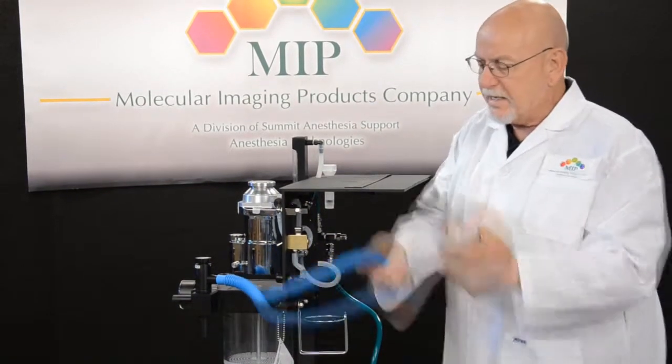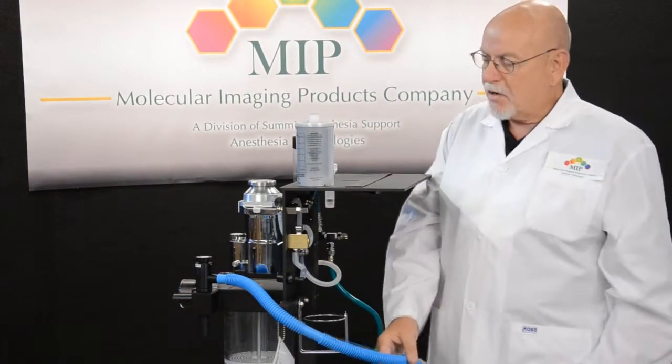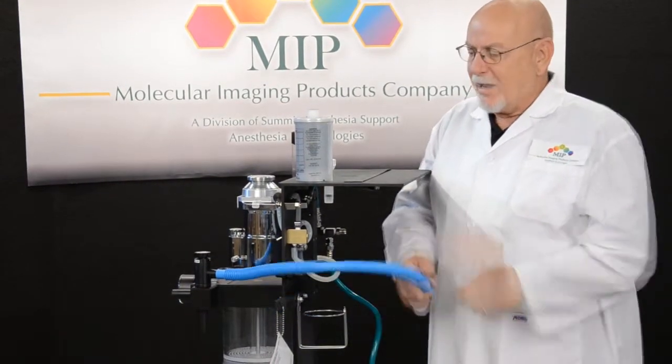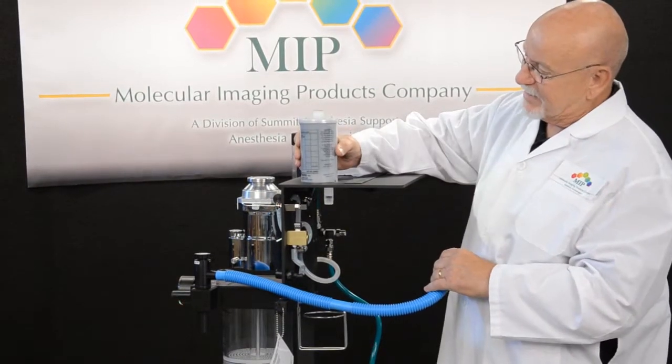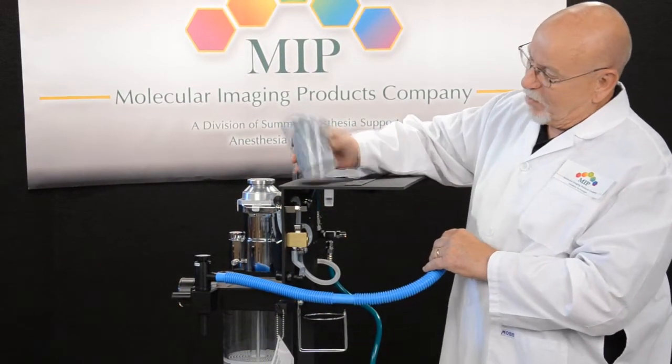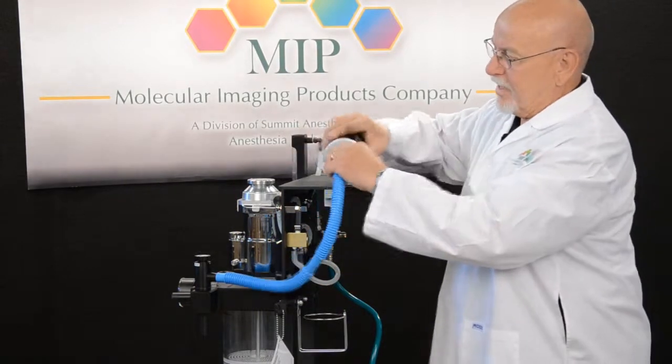What we don't want to see is the activated charcoal filter placed in a position like this, or have it on its side. The reason is, if it's placed like this, there's really no way for the gases to escape through the activated charcoal canister.